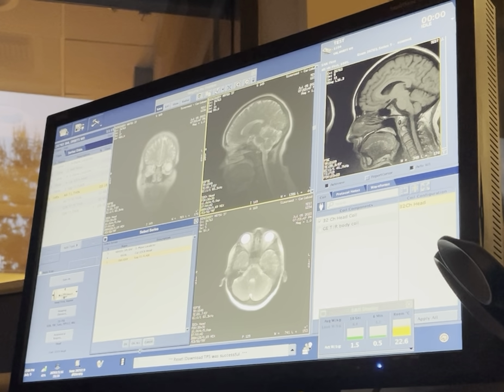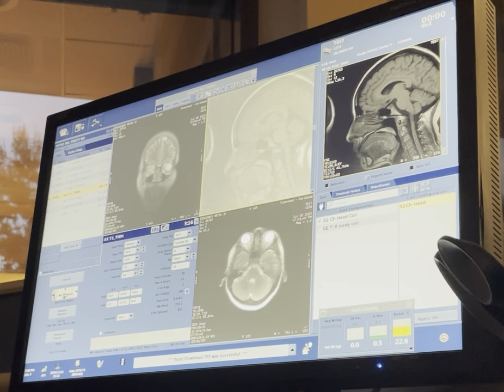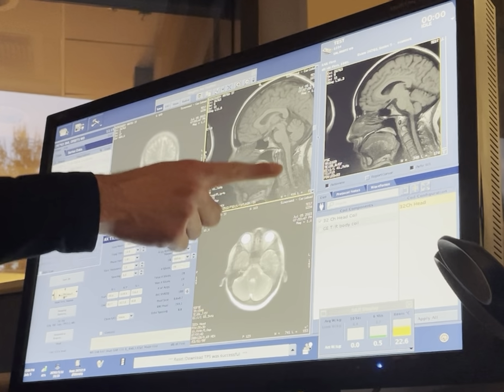Yep, click that and then click OK. There we go. Now brighten it, go left and slightly up. Gentle. Go down a little bit. Yeah, there you go. Okay, so this is midline, hence the brainstem, and you can see it down here.